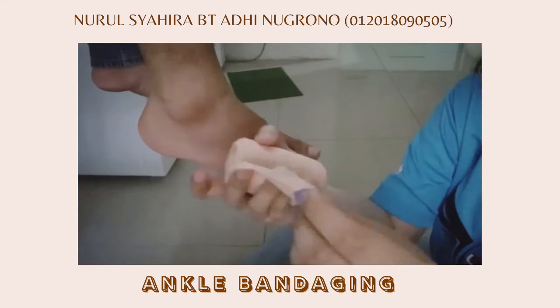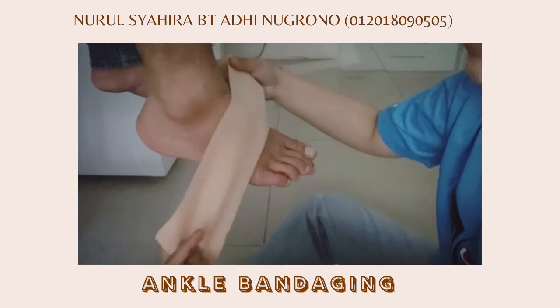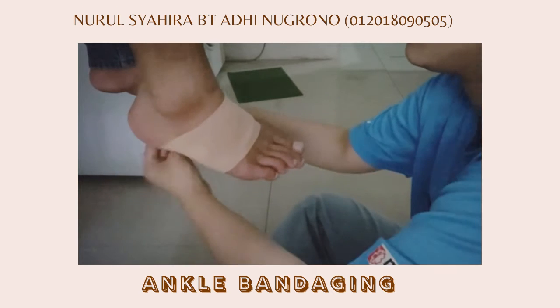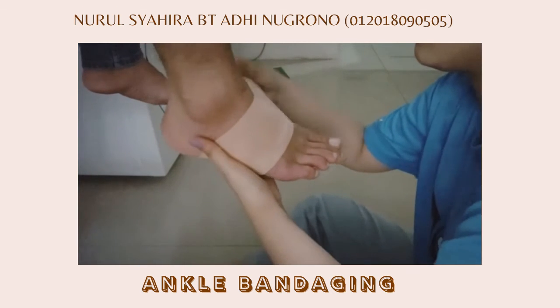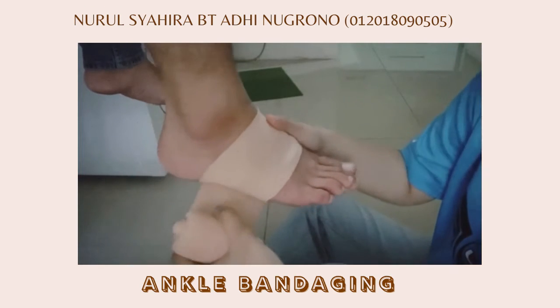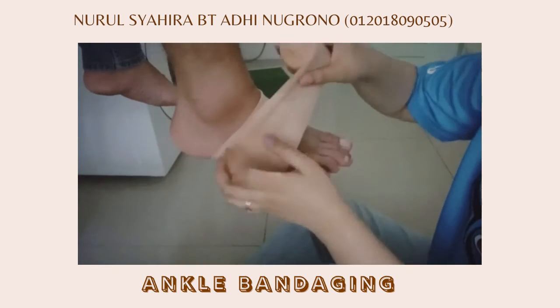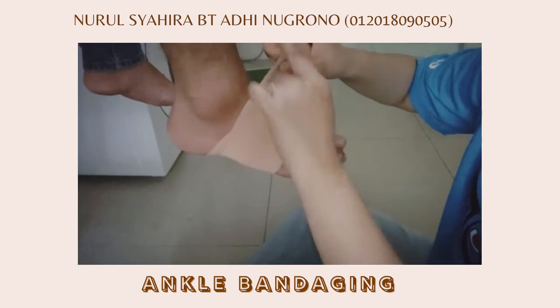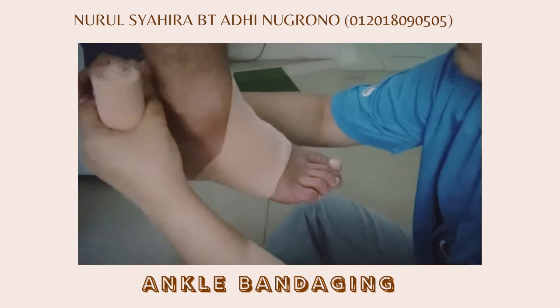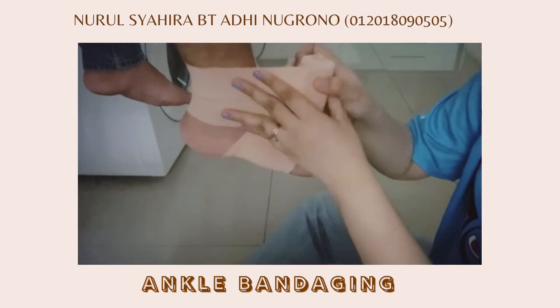You need to make sure the position of the foot is at a 90-degree angle from the ankle. Next, you need to start wrapping the bandage around the ball of the foot. Place the end of the bandage on the top of the foot next to the toes. Once the bandage is back around the top of the foot, you can tuck it a little to keep it tidy and to keep the end in place.